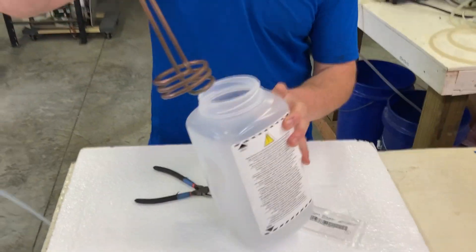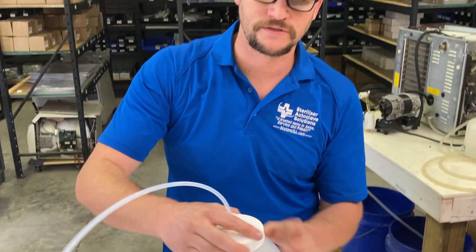And that is how you change the wastewater bottle fitting on your Cycan products. Thank you. If you have any questions, please give us a call.